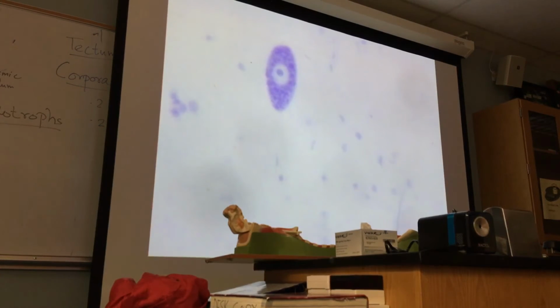Do you see any axon? But you can figure out because you can see a little remnant here, but I'm not very sure. So you don't see any dendrites or axon. You see only the whole cell body, isn't it? And you see the Nissl bodies, do you? You see the nucleus, you see the nucleolus.